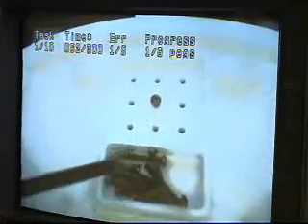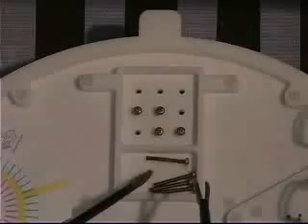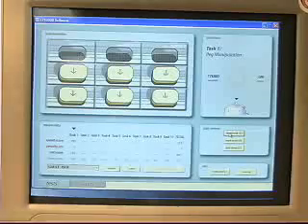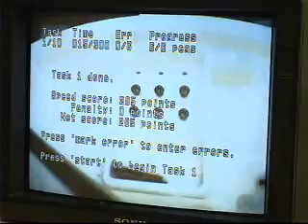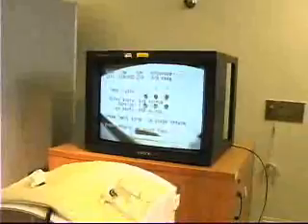Ten penalty points are assigned for each peg dropped, up to a maximum of 60 points. A summary screen will be shown after each task and includes the final score, the penalties, and the time taken.